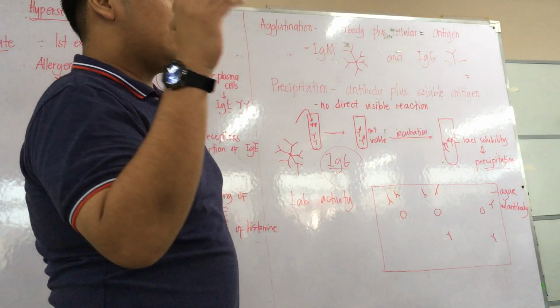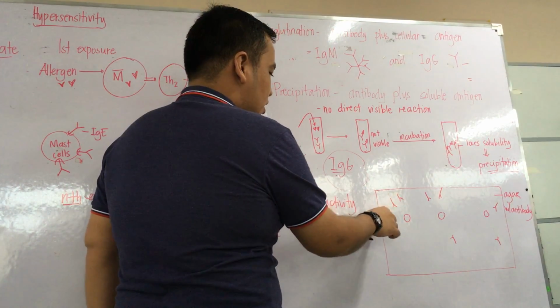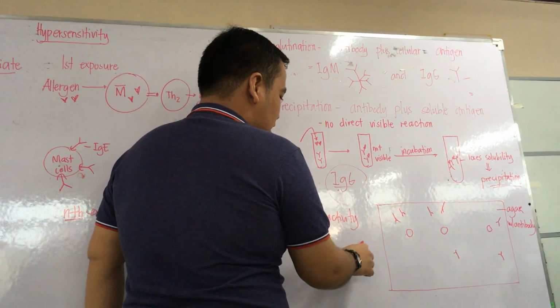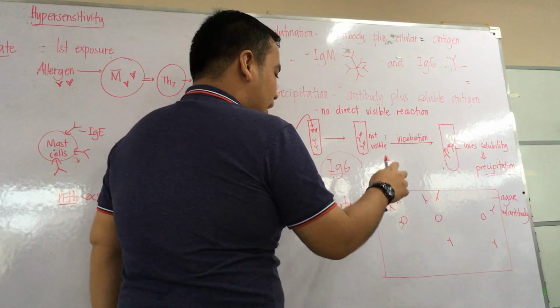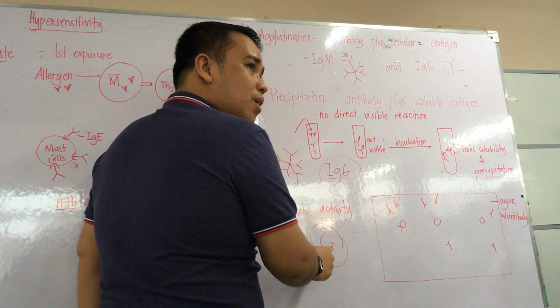Now what you will do in experiment number 3 is that you have the agar to which the antibodies are actually suspended, and this is your well. This is where you're going to place your sample. I think the sample that we're going to look for the blood is C3, one of the complement product.